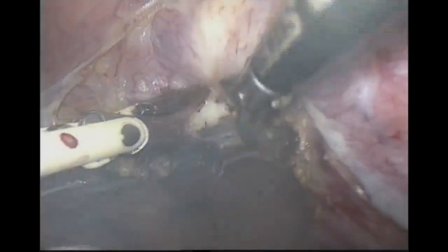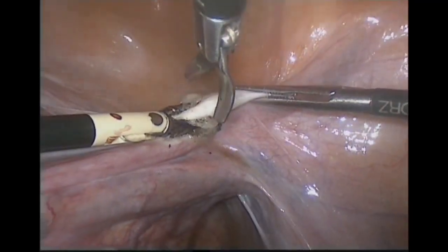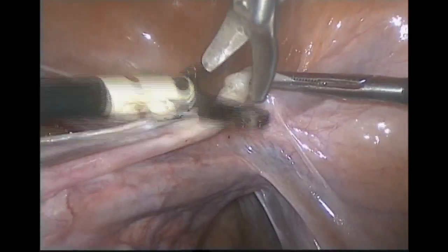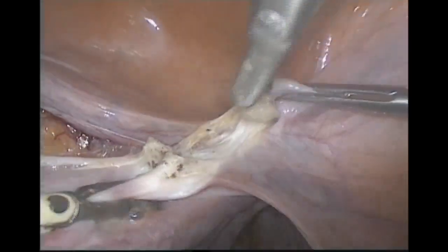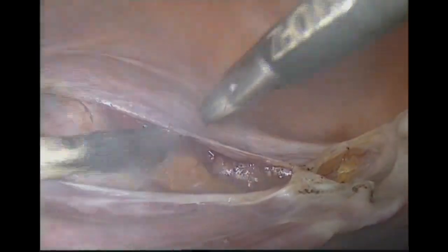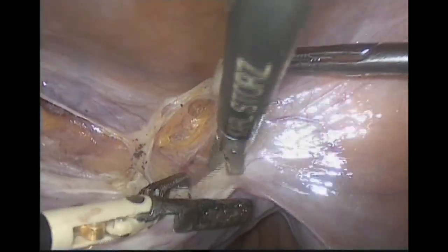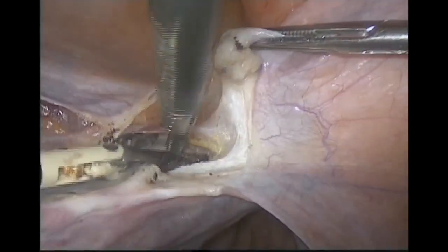Hug the uterus here also. Above, hug the ovary to take the IP ligament. Below, hug the uterus to take the uterine artery. On the other side, to make the specimen highly mobilized, go to the round ligament, then coagulate the round ligament toward the lateral pelvic wall, leaving a short stump of the round ligament to mobilize the uterus during the operation.